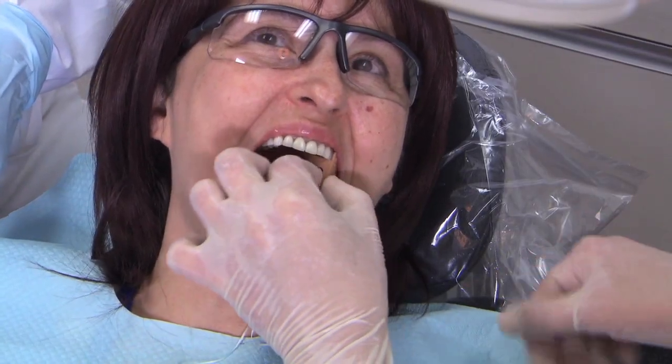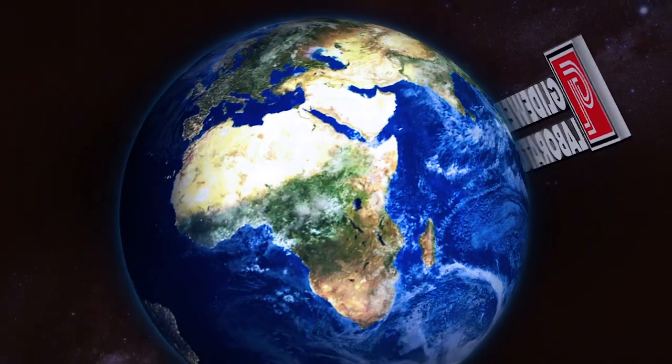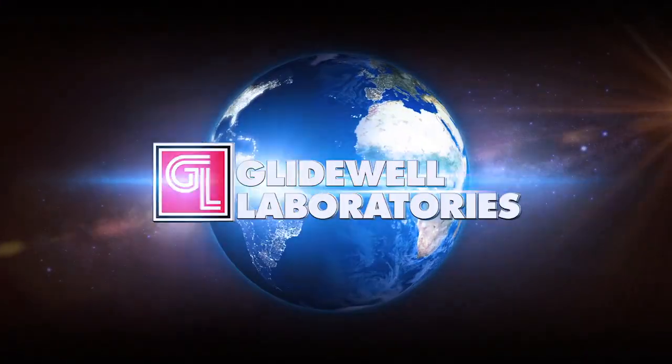It's been two minutes — actually a little more than two minutes. I'm going to go ahead and remove that, Ana Maria. Let me ask you — and I want you to be perfectly honest unless it's an answer I don't want to hear — are you starting to get numbness? Upper and lower. Upper and lower — Kathy, what does that mean, was I in the wrong spot? No — remember that the maxillary branch of the trigeminal nerve is going anterior at about the same point that the mandibular branch is dropping down. So when we're up at that height, we can definitely get collateral anesthesia. People will often have their auriculotemporal nerve also anesthetized, so it's not at all uncommon to have the ear feel some numbness too. Thank you — that was awesome.